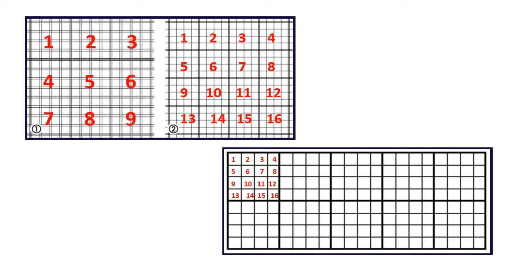Recall natin yung ating mga counting chambers. So, improved Neubauer itong una. Okay? Ilan ang sections ng improved Neubauer? 2. Ilan ang area natin? 9 square millimeters. The depth is 0.1 millimeter. And ilan ang squares? 9 squares sila. Okay? And then, sa Fuchs Rosenthal naman, we have 2 sections as well. The area is 16 square millimeter. The depth is 0.2 millimeter. And ilan ang squares daw sa Fuchs Rosenthal? 16.